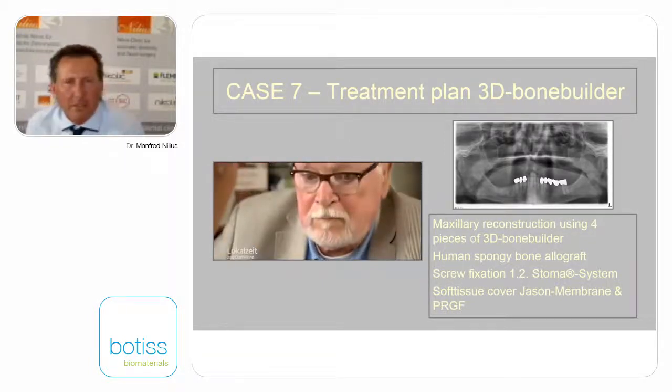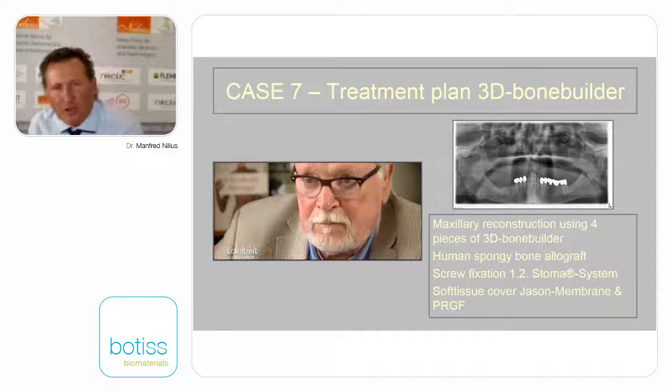is sending you, if you want, a 3D model, so you can do the explanation to the patients as well.